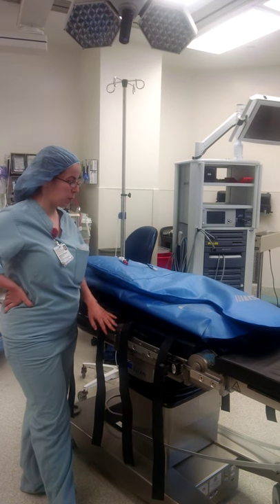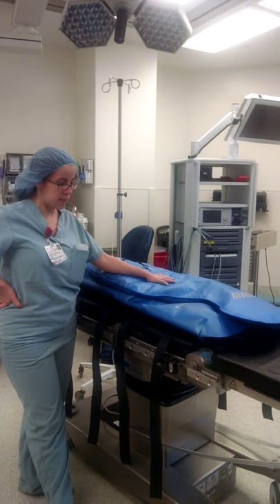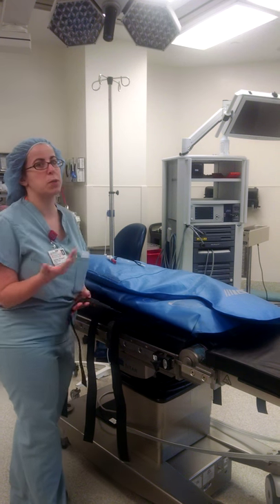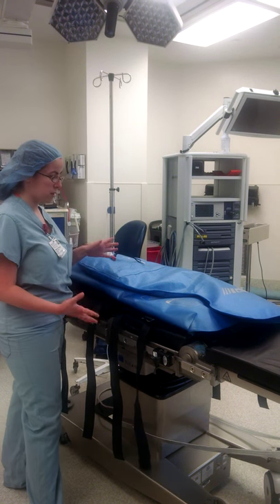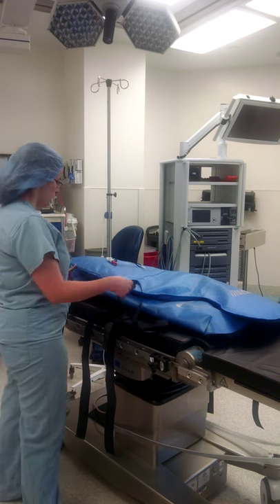Today I'm going to show you how to put the Blue DaVinci Bean Bag on the bed and set up for the Steep Trendelenburg case. We only use it for Steep Trendelenburg to keep the patient on the bed, so it's very important that we have the bean bag on properly.